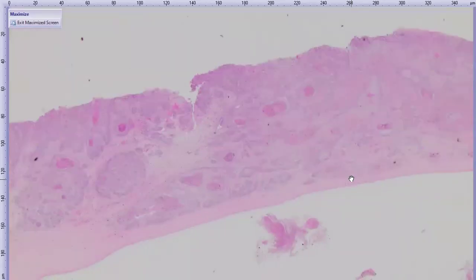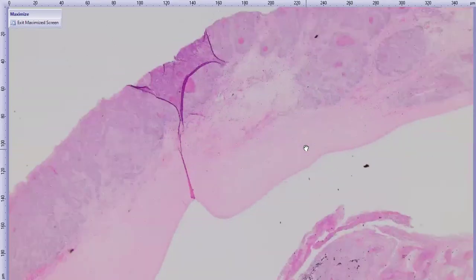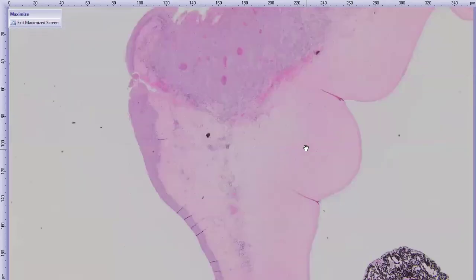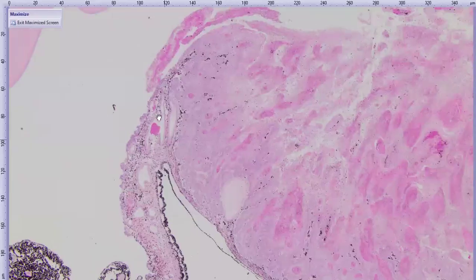All right. So this neoplasm, you can see from magnification, is forming these lovely, lovely for a pathologist maybe, multifocal to coalescing lobules. And a lot of these purple lobules have this bright pink in the middle, which is very suggestive. Here it is in the cornea, and then we give way after this tumor to more normal non-neoplastic epithelium of the cornea. And then we can see it down here invading the uvea. So it's in the iris base, and poor little iris is just flapping off the end, and then really severely distorting the ciliary body.